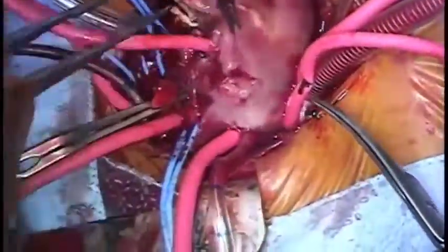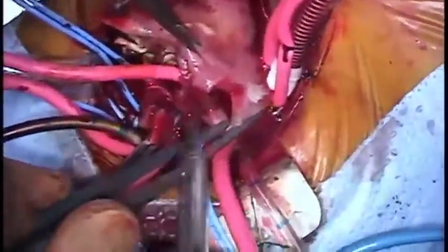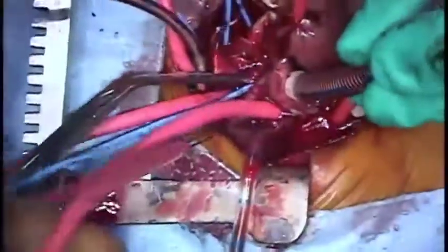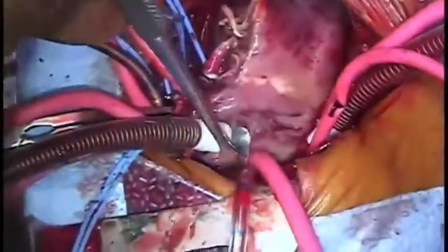The right atrial appendage cannula is now clamped and removed. The flow is reduced and the IVC cannula is snared. The right atrium is now opened parallel with the AV groove and the right atrial cannula is then inserted into the SVC via the atrial incision and snared in place. It's secured by tying the snare to the cannula.